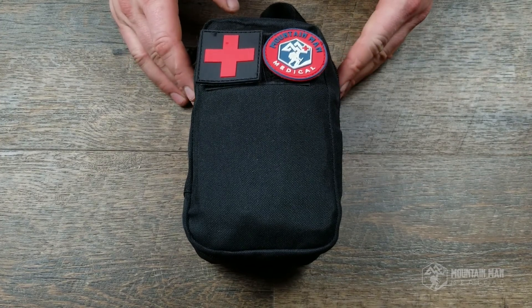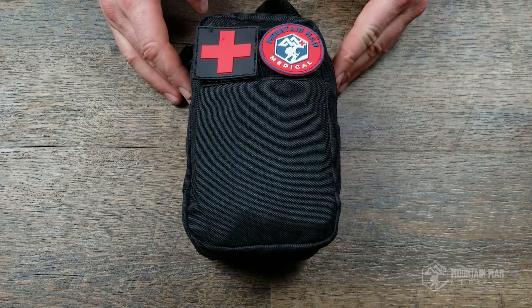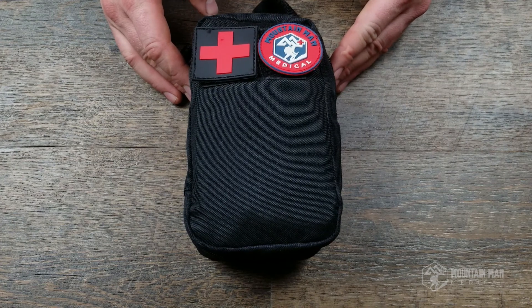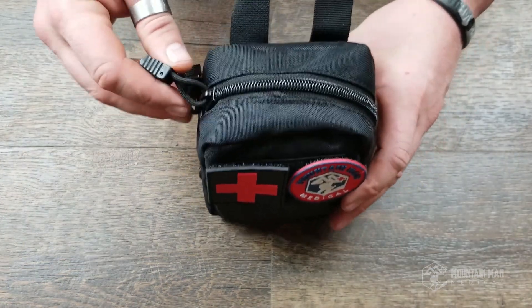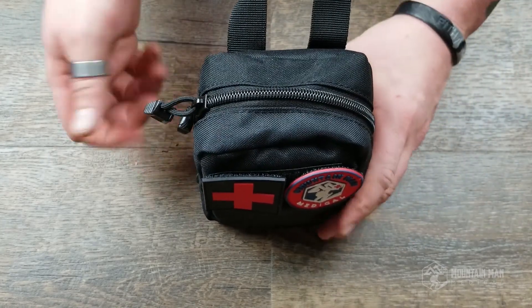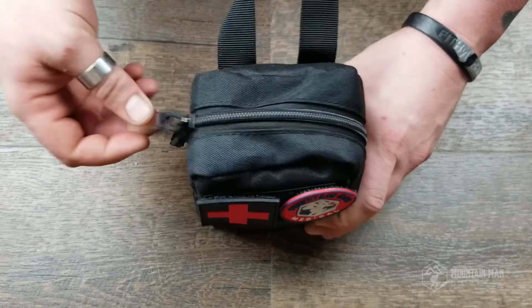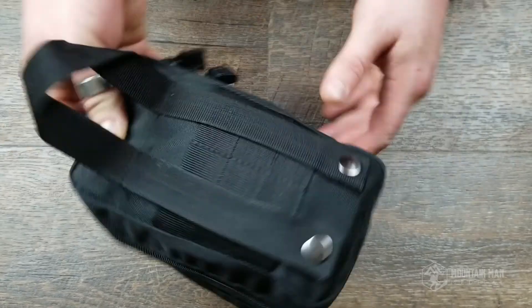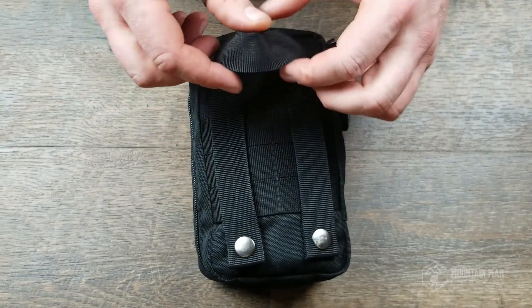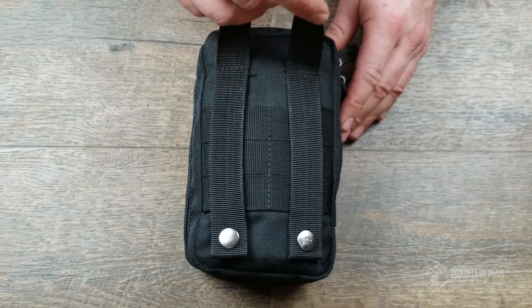One of the things that was important to me was making sure that we had good quality zippers. I put my medical bags through some pretty austere environments and generally the first thing that fails are the zippers. I really wanted to make sure we're including some quality zippers that aren't going to fail at a moment's notice. There are pull tabs so you can grab it if you're sweaty, bloody, or in the middle of the night. There's also a grab handle on the back, which is important for being able to rip it out of the bottom of a backpack quickly.